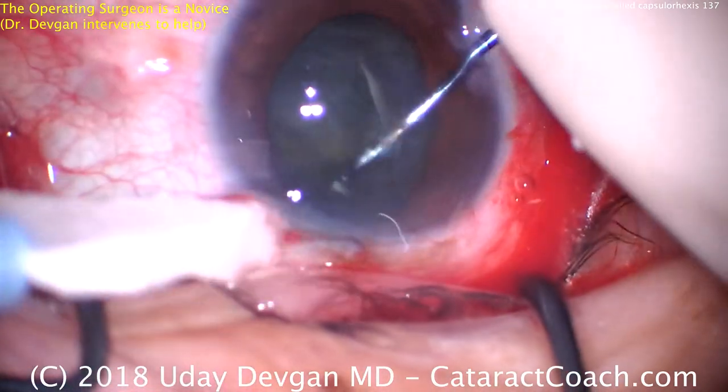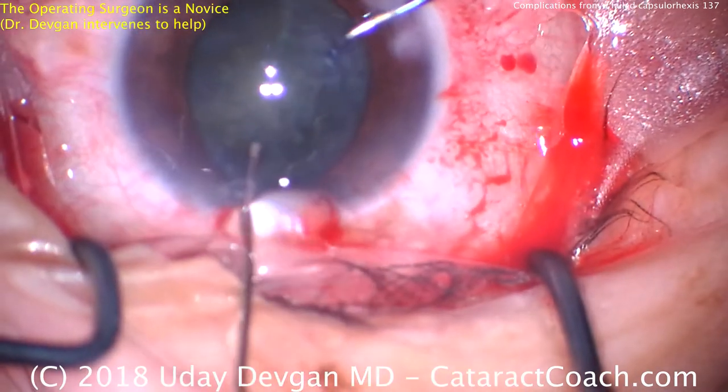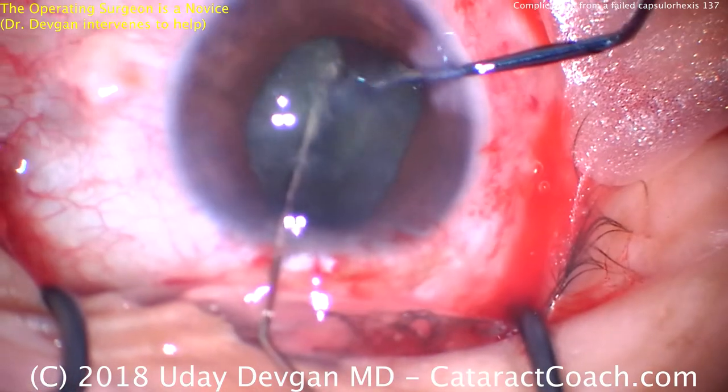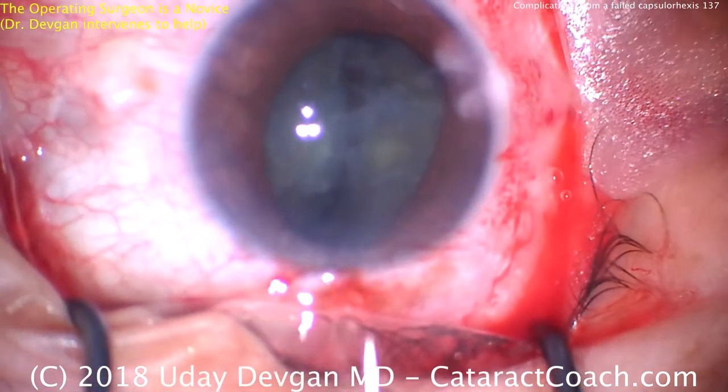There's no vitreous prolapse — we're still okay here. The nucleus has been hydrodissected and I'm going to help right now. Just using a cannula in the chopper, let me help split the nucleus into two halves.